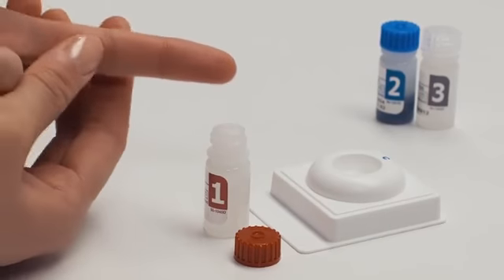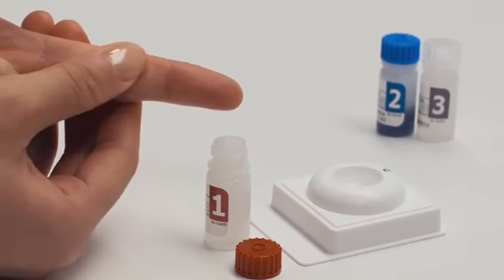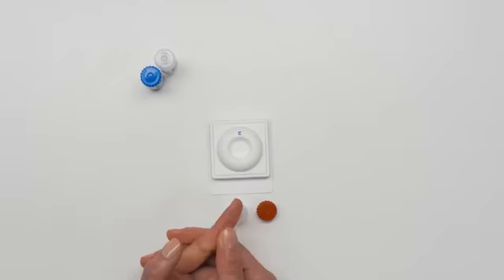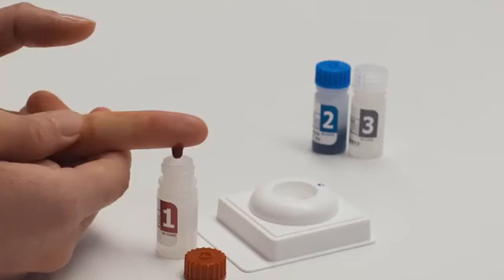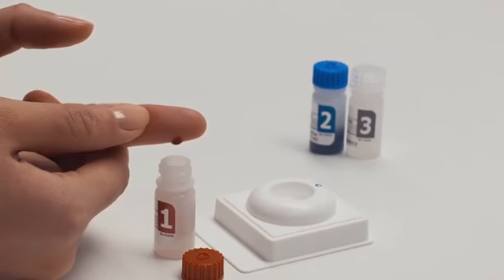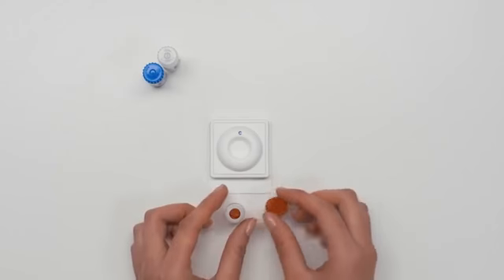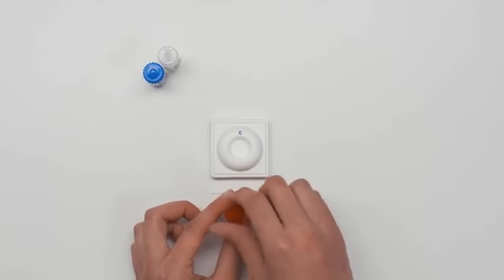Rub the finger to get a larger round drop of blood. Let one drop fall into bottle one. Twist on cap of bottle one. Apply a bandage.